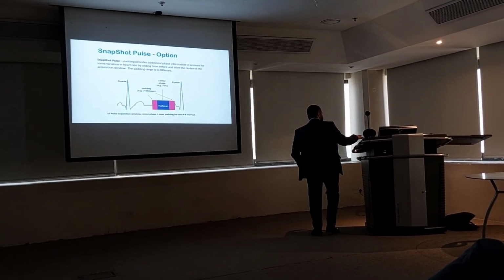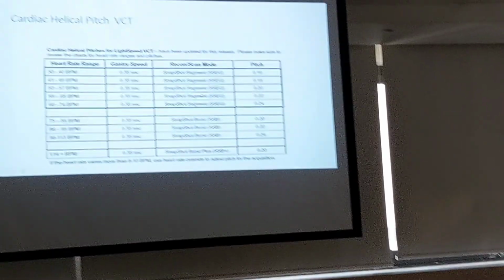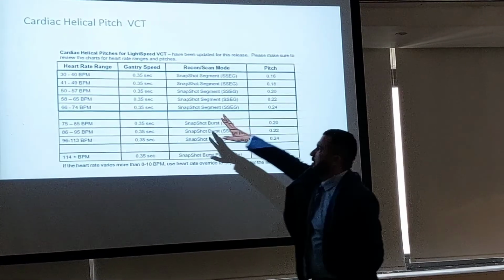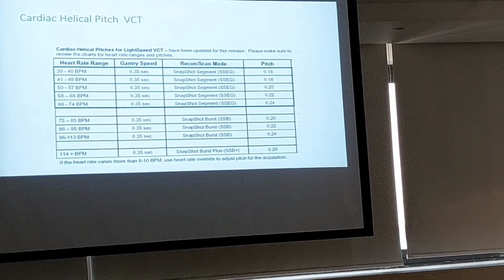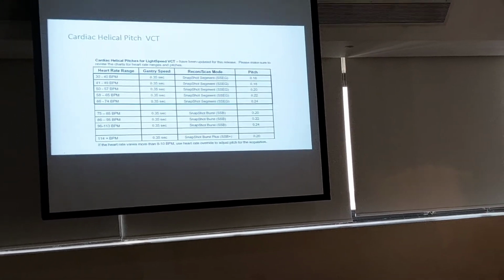These are the pitch levels. Now, with the helical, we are using pitch. And these are the sets of pitches used in the protocol. We don't have control of this directly. I will show you how we can do it.